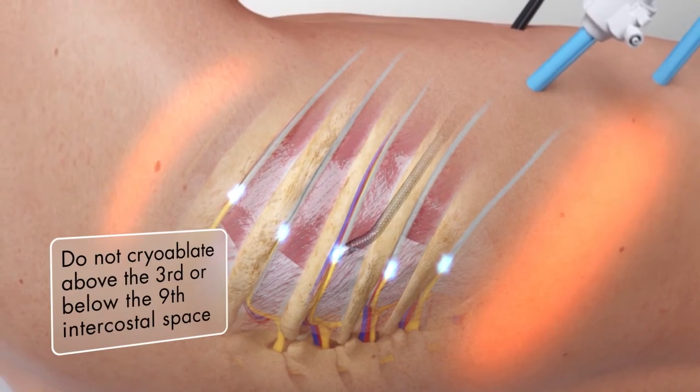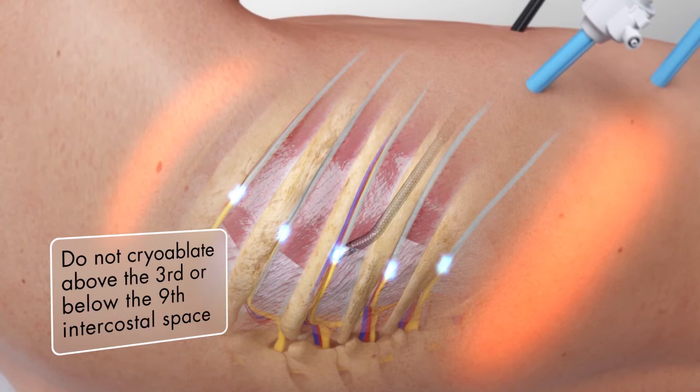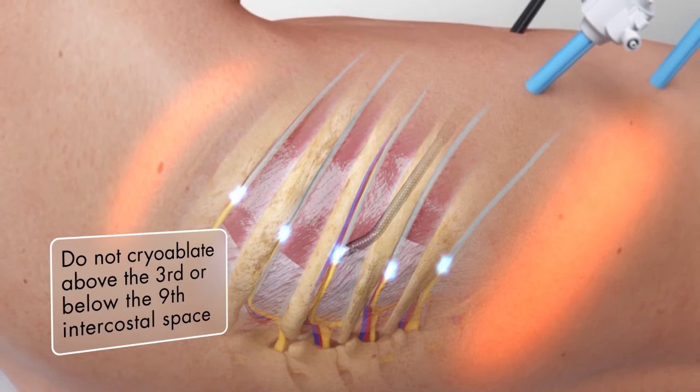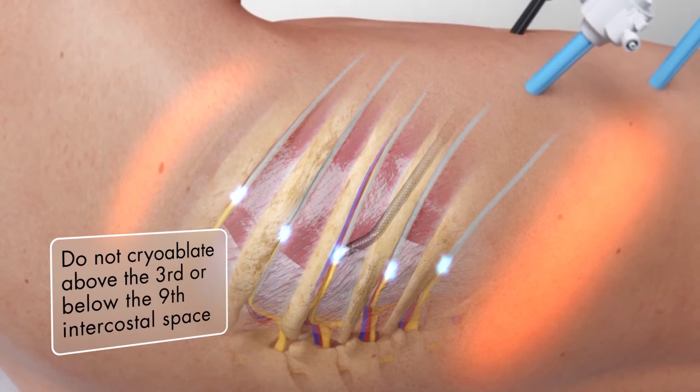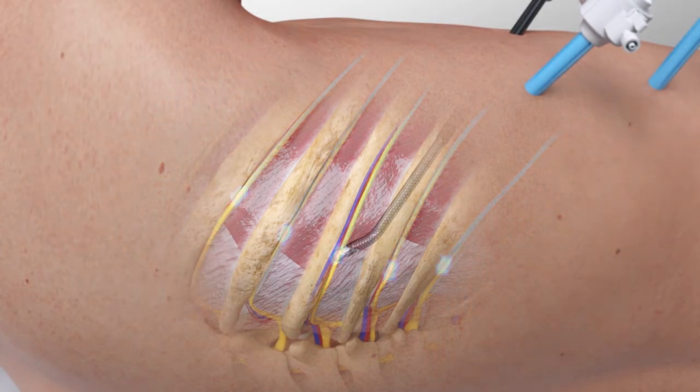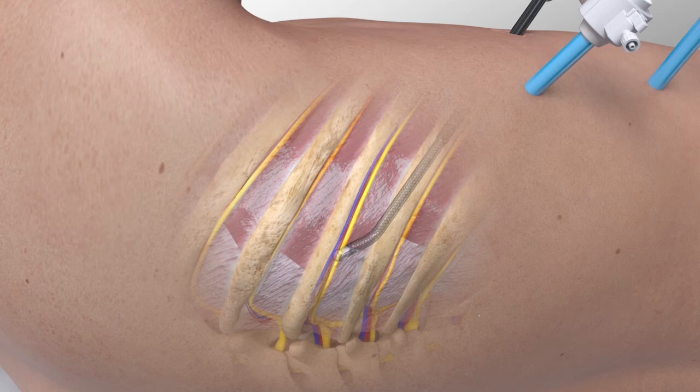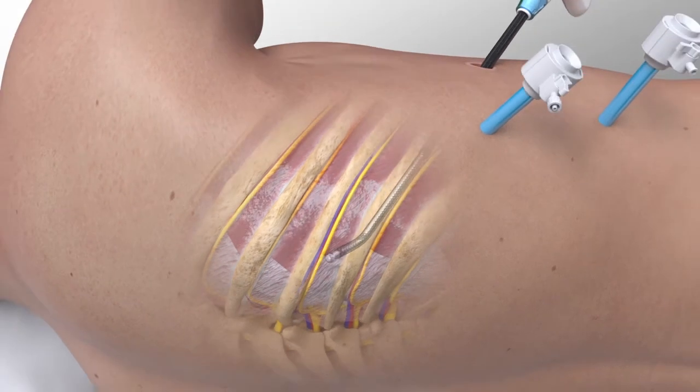Take note not to cryo ablate above the third intercostal space due to proximity of the sympathetic trunk or below the ninth intercostal space due to risk of abdominal muscle bulging. Once the two-minute cycle is complete, the active defrost feature initiates, allowing the probe to be easily removed from the cryo ablation site.